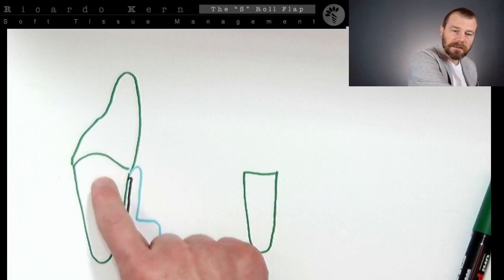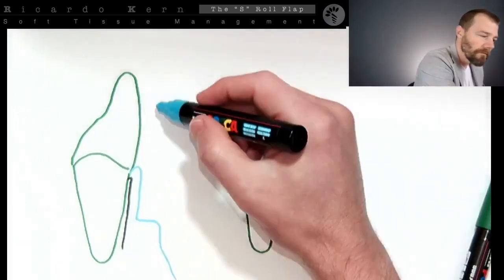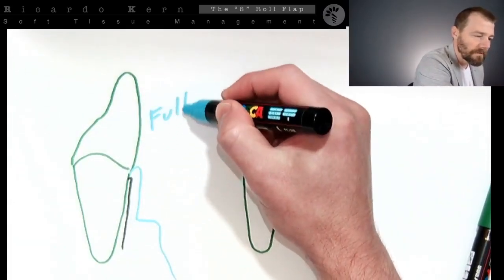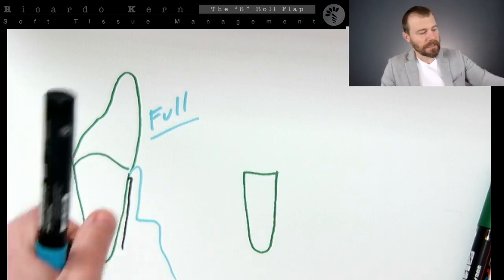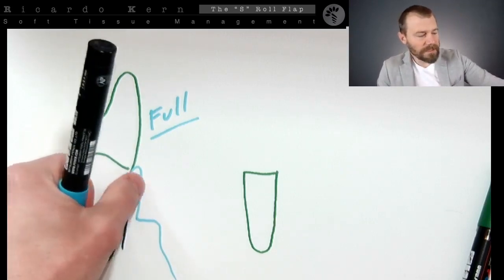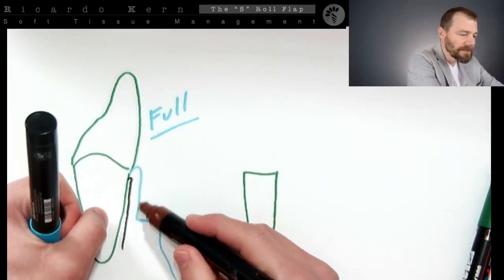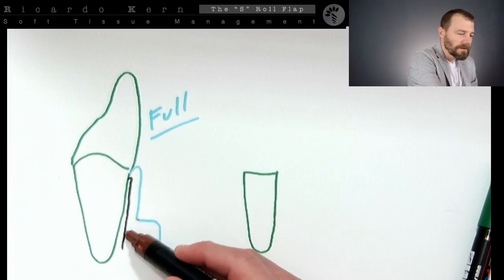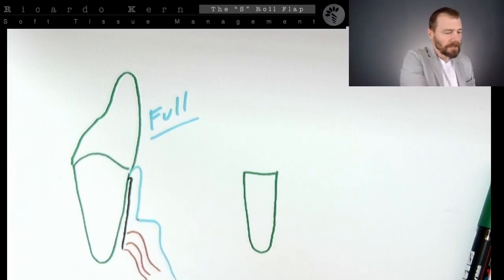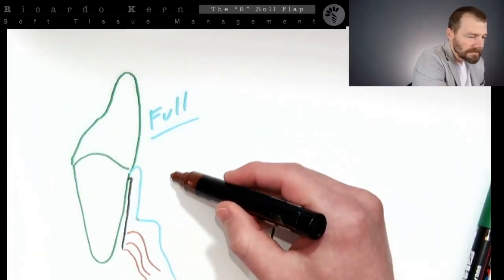So in this kind of situation, when you treat natural roots here, you're going to use a full thickness flap, okay? And let me explain something that is nice for us to understand. What you have here on this area, the keratinized area, because remember, I have keratinization until the mucogingival line, and up to the mucogingival line, you have the mucosa and the muscles here, right?